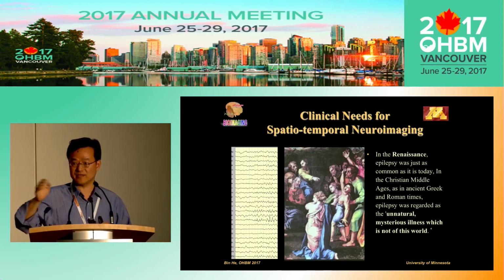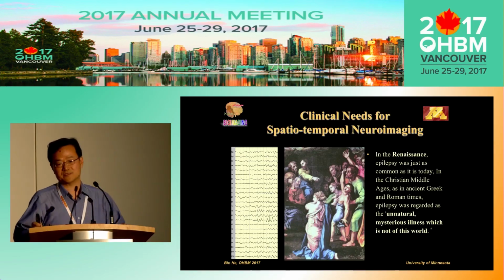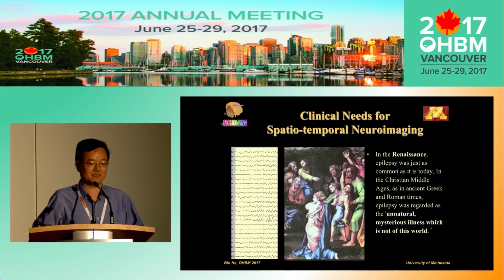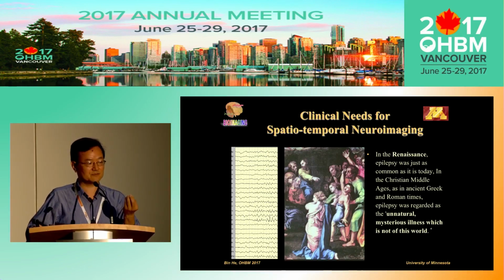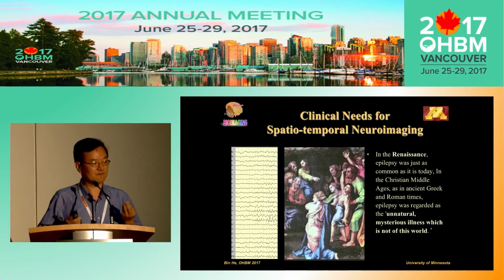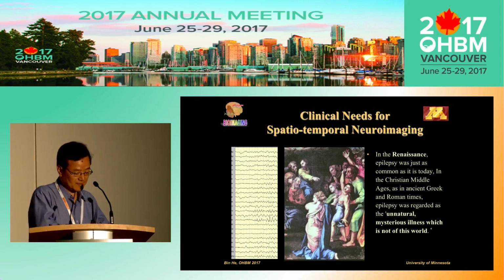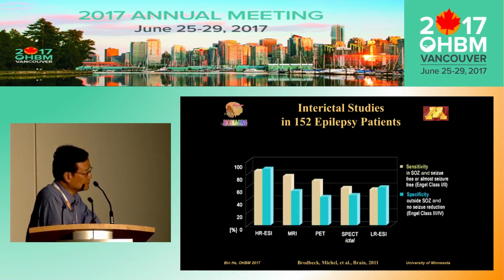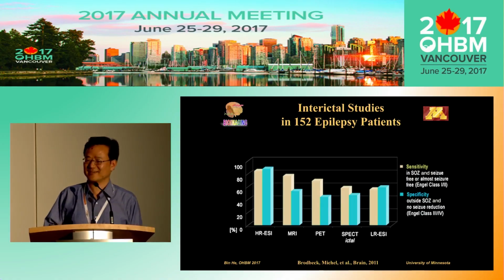As Christopher mentioned, the temporal dynamics is very well illustrated in epilepsy. Spatially, for example, there's another way: if you're going to study Alzheimer's disease, that brain activity is probably very smooth. Now, whether EEG and MEG is the best solution needs to be thought about very carefully. I don't know if it is or not, but epilepsy is clear, and EEG and MEG will probably be a very good solution.